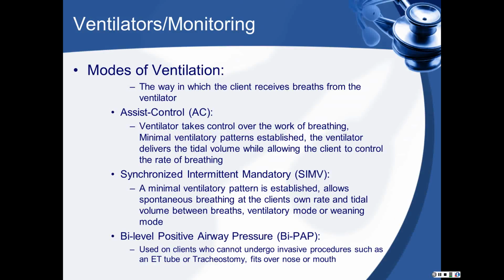AC ventilator. If the client does not have spontaneous breaths, the AC ventilator is used. The vent will establish a ventilation pattern. The AC ventilator mode delivers 7 to 10 milliliters per kilogram of air to the client.